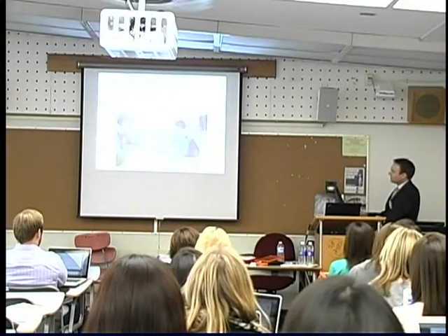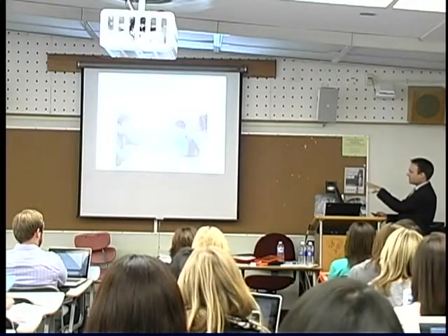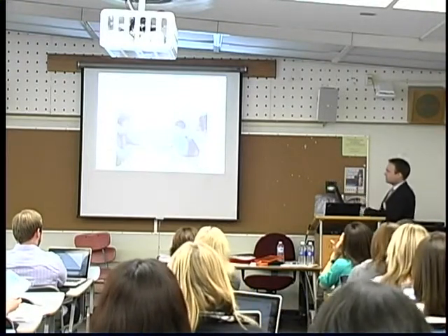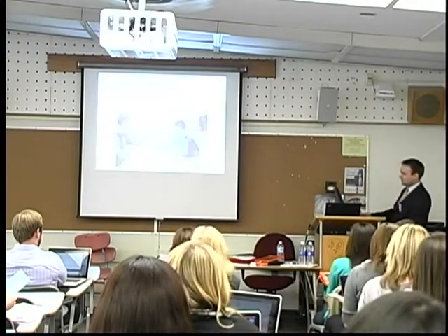All right? And this is now, we started directly with an iPad, followed those PEC stages, so same protocol, and this is now in the middle of those interventions, of that intervention. He is learning to do a little I want plus desired item sentence on his iPad.